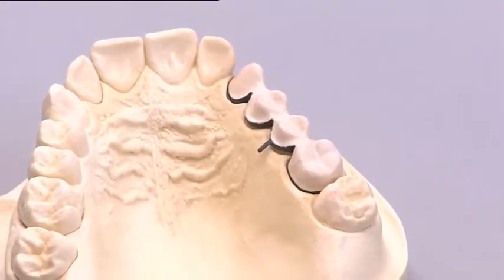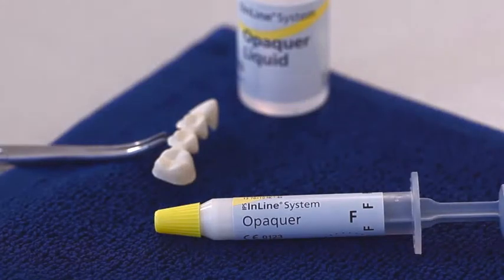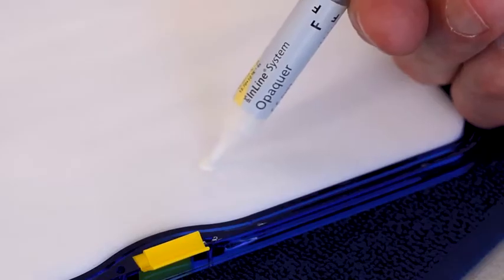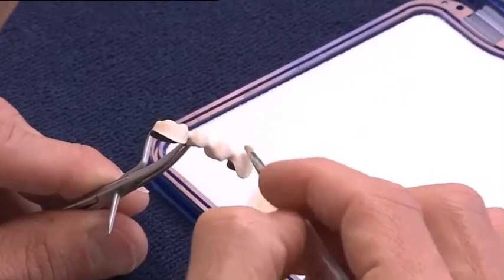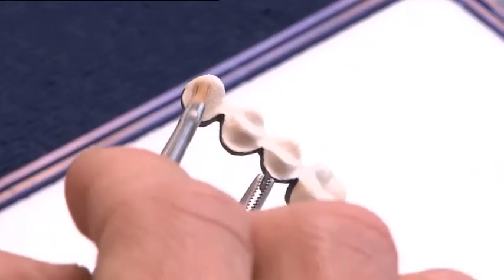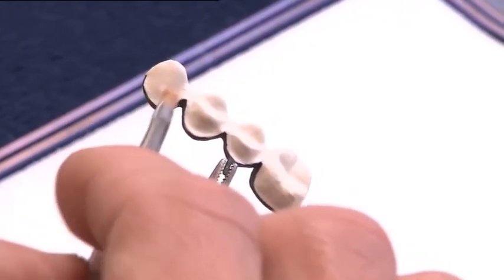For enhanced in-depth fluorescence, the opaquer F can be used. Either apply the opaquer F as a thin third opaquer layer and fire, or mix up to 20% of opaquer F with the conventional opaquer before the second layer is applied.